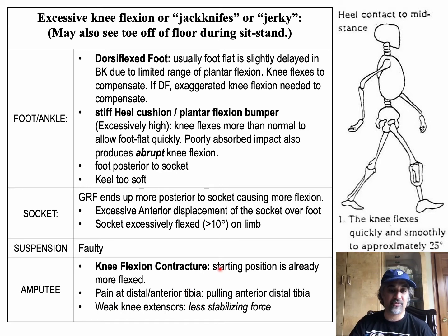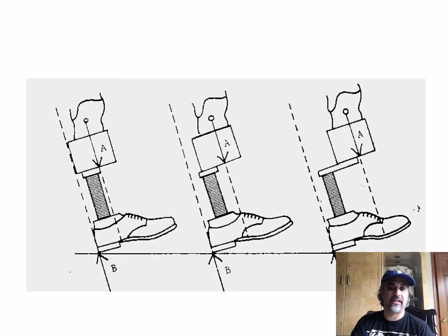So that should kind of follow from the last slide. And on this slide, you can see if we put the foot further and further back on the socket, then we get kind of the same effect with knee instability.